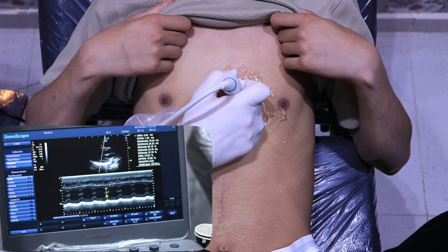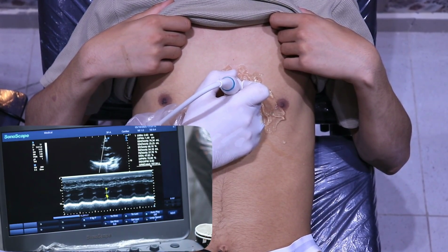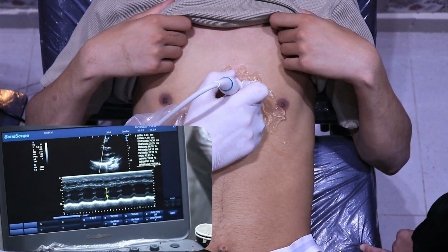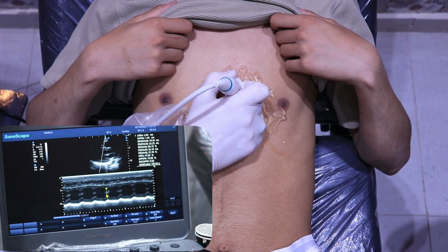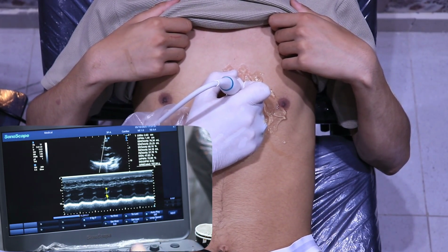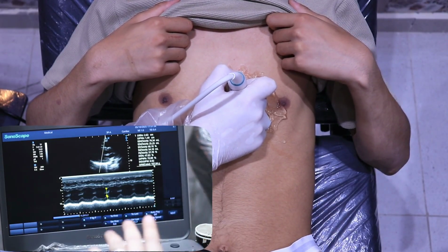And this patient has a heart of how many grams? 100. برافو يا دكتور. Left ventricular mass 107 جرام. ايه ده؟ قلب عصفورة 100 جرام. يعني احنا دلوقتي لو طبخنا قلبك ده 100 جرام هياكل مين ولا مين؟ ده حاجه صغنطوط جدا. فده قلبه صغير جدا بسم الله ما شاء الله، ودي حاجه كويسه على فكره. So this is how we measure the ejection fraction.